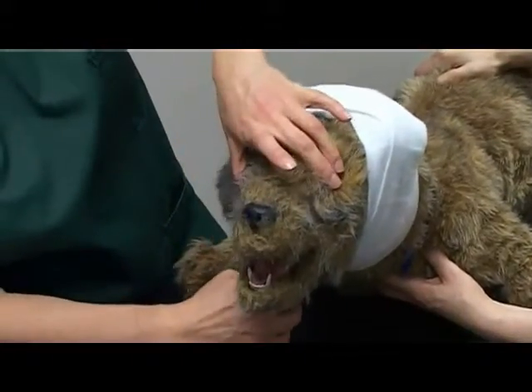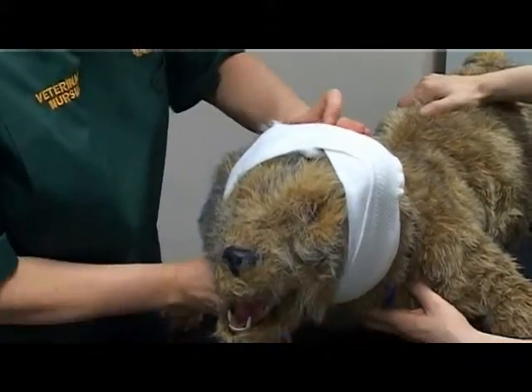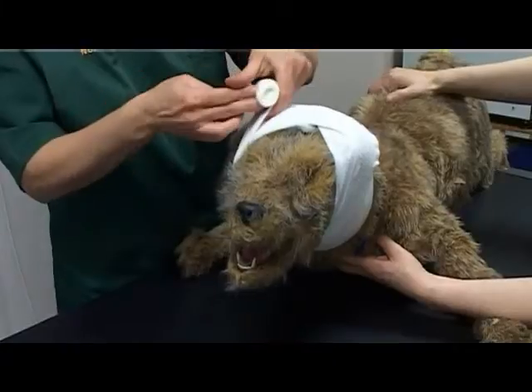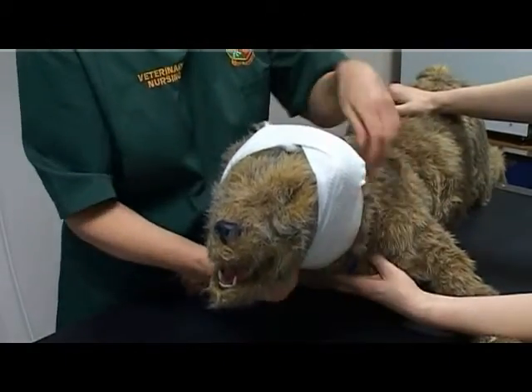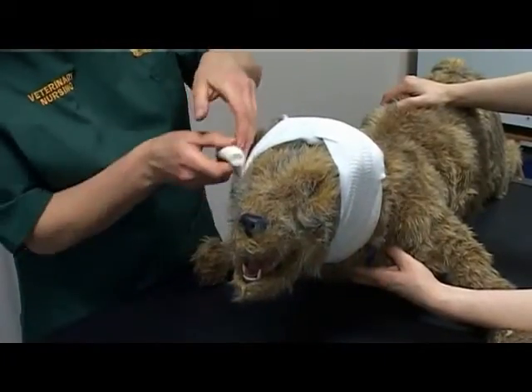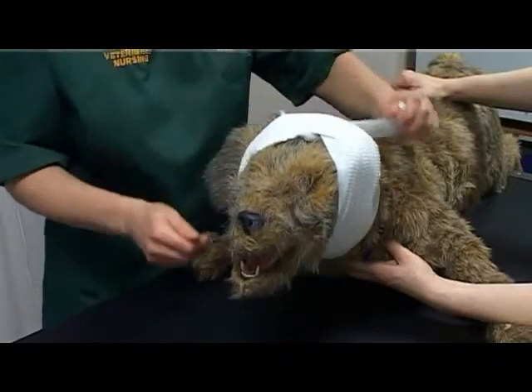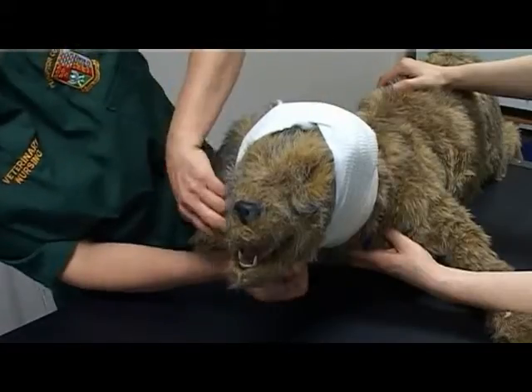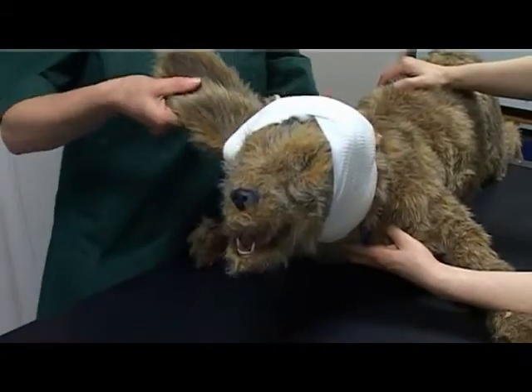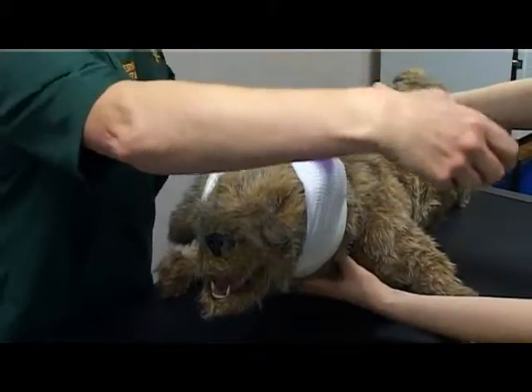Check the airway is not restricted. Apply conforming bandage in a figure of eight fashion around the head with the unaffected ear exposed. Again, check the airway is not restricted. Apply an outer protective layer in a figure of eight fashion around the head with the unaffected ear exposed.